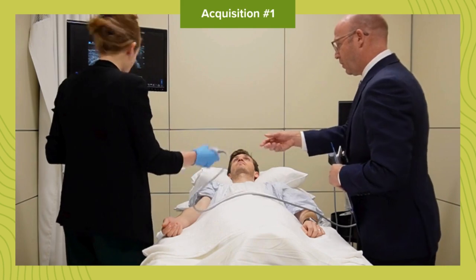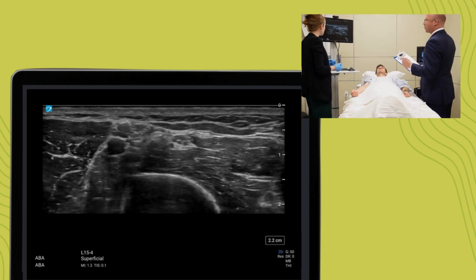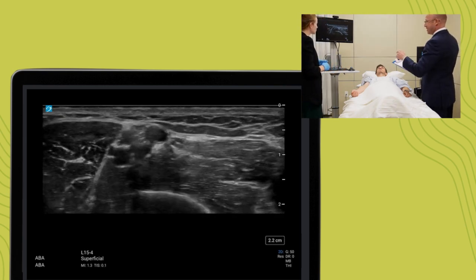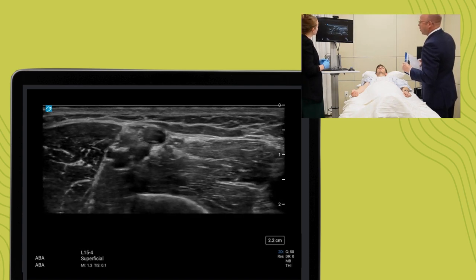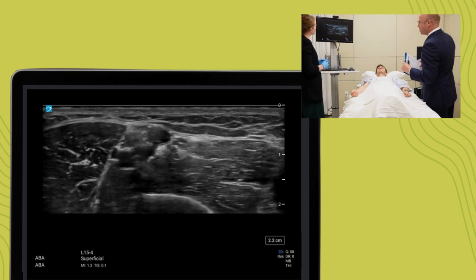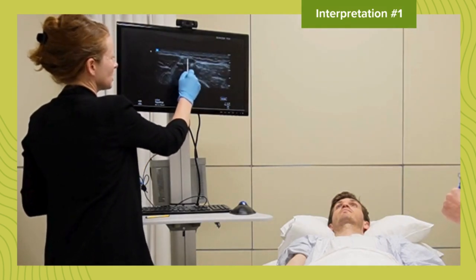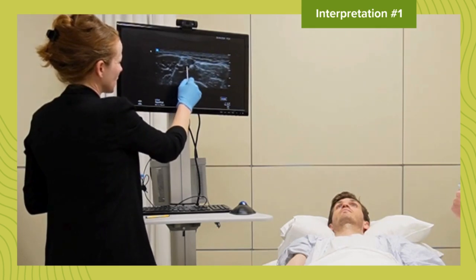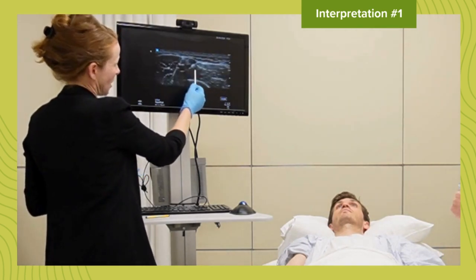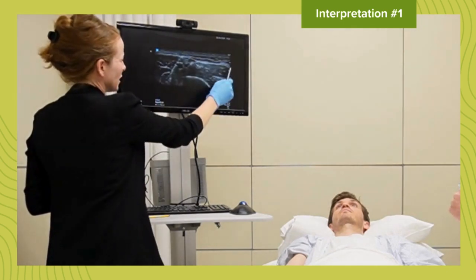Great, Doc. I'll take the probe from you. I'd like you to draw your attention to the screen. Assume that the video you are currently seeing is the video you just obtained. Using the stylus provided, I'd like you to point out any significant anatomic artifacts or important structures that you would see on this image while you place the IV. I'm seeing this circular, freely compressible structure here, consistent with a vein — that would be my target. I'm also seeing some other anechoic structures that are not compressible, so those would be arteries and I would stay away from those. And this is muscle here as well.